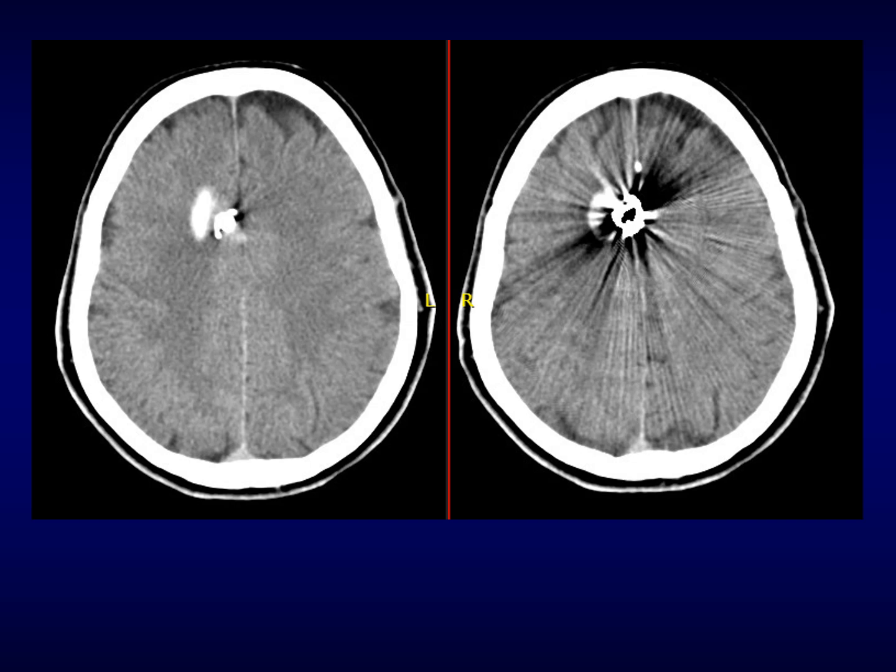But what I didn't show you is that at the end of the procedure of the embolization, we could see on the CT scan this small but obvious hemorrhage, which was due to the traction on the microcatheter at the end of the procedure in order to take it off the vessels.